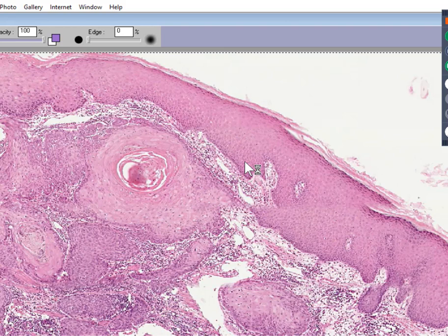Unfortunately, believe it or not, even though the basal cell carcinoma is by far the most common cancer ever in any human being, we didn't have any good slides of it. So either there was never any slide in the collection, or maybe I lost it or something. Or maybe somebody broke the glass to it.